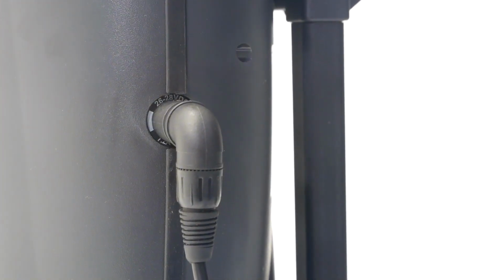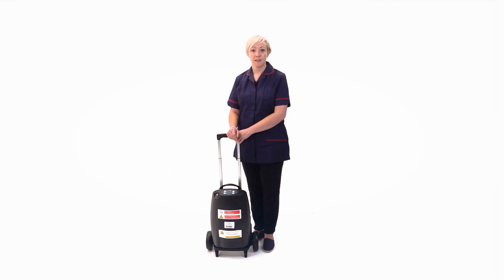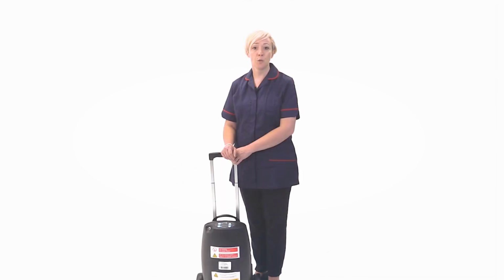You can still use the device while the battery is being calibrated. This process ensures the longest possible battery durations. The device should run for a minimum of 2 hours each month. All preventative maintenance is performed by your home oxygen provider, and unauthorised individuals should not attempt to open or service the device.